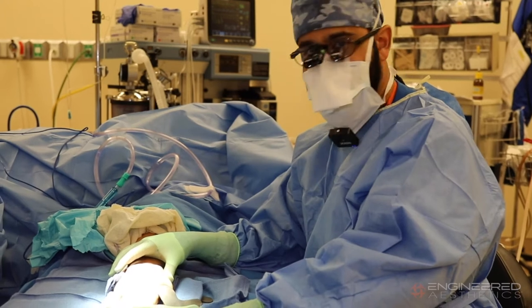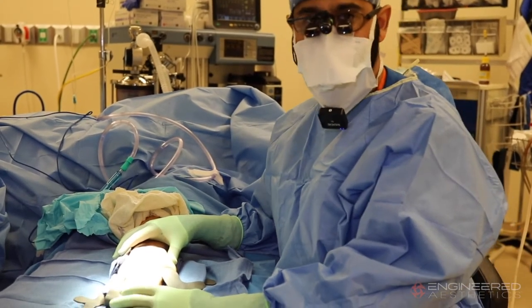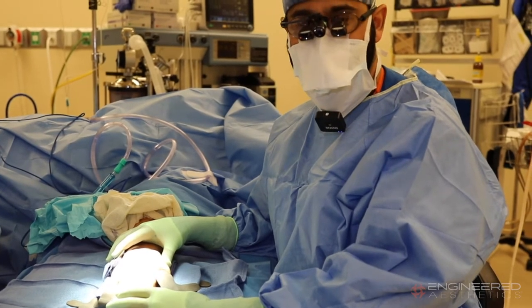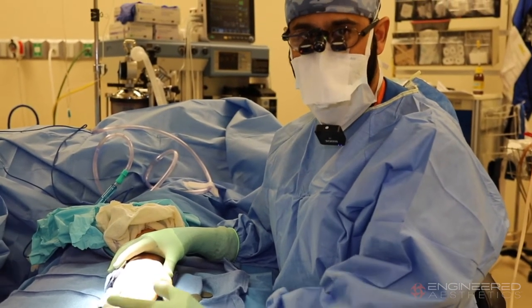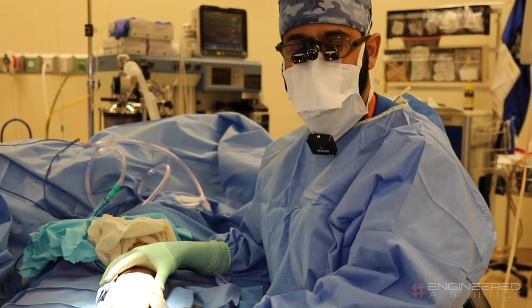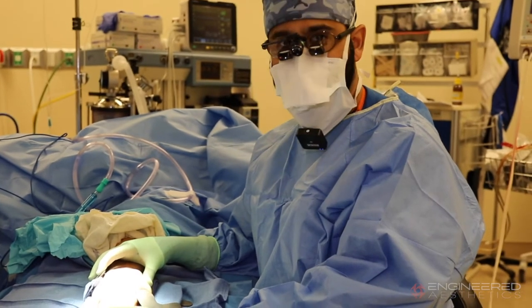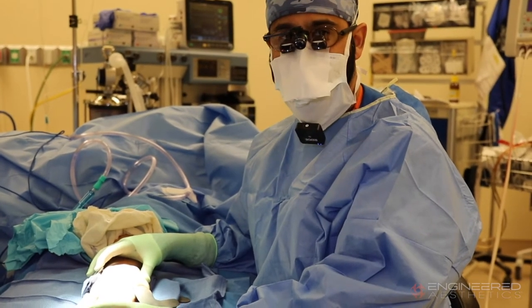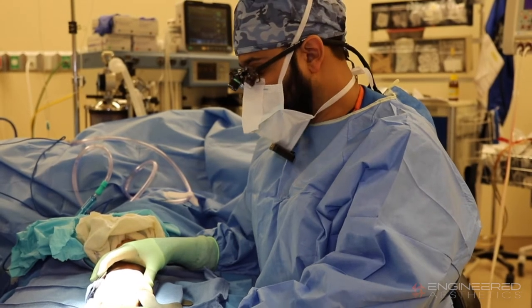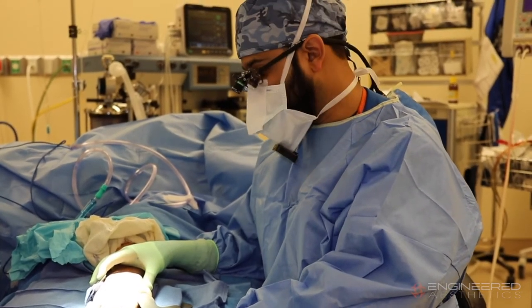We have a patient with multiple problems affecting her left hand. She has a peripheral compression neuropathy of the median nerve called carpal tunnel syndrome, a peripheral compression neuropathy of the ulnar nerve at the wrist at Guyon's Canal, and on top of that she has Dupuytren's disease affecting the middle and ring finger. We're going to approach all of those at the same time through one long incision.